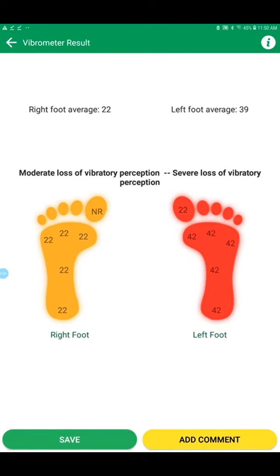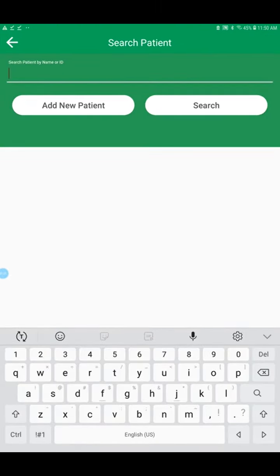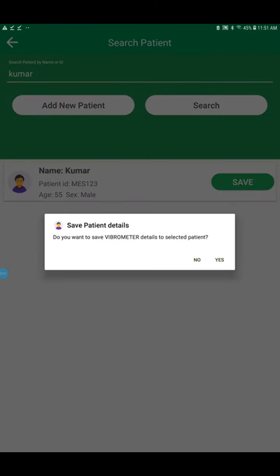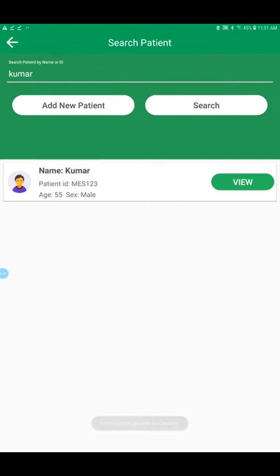As per the interpretation, right becomes moderate, so it becomes orange. Red is severe, then it becomes red on the screen. If you want, you can add a comment or you can save. You can search the patient if you know the patient name, or you can also search by ID. If I search for Kumar, there may be multiple Kumar, so all the Kumar will be listed. But the ID is also shown there, so you can select the correct ID. So it is saved.